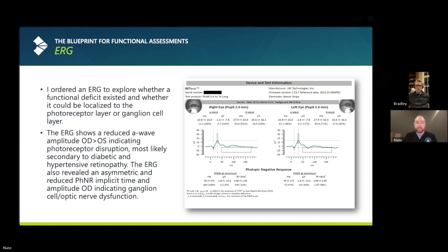And just so you guys know too, as far as the normative database ranges that we have, that actually does go down to the age of 4. So technically speaking, you can use it if you ever decide that you wanted to, and still get a colorized report.